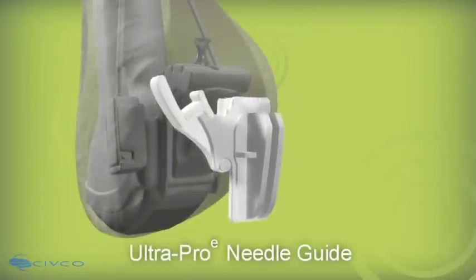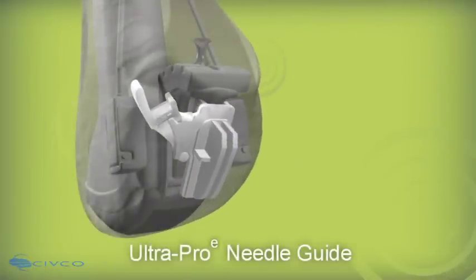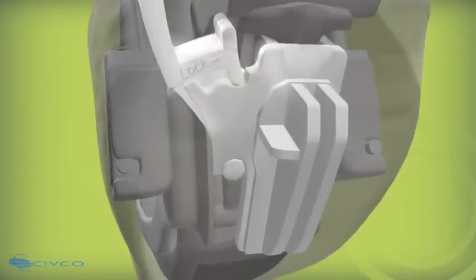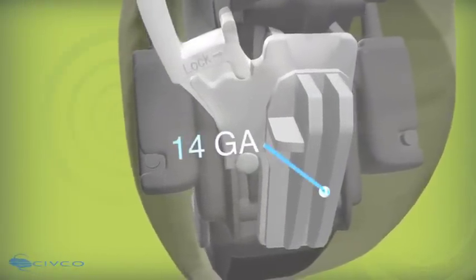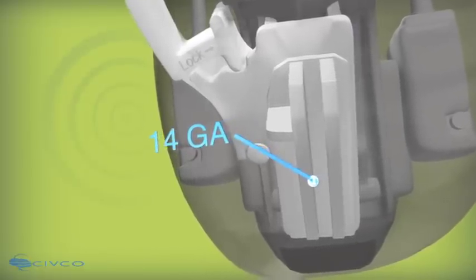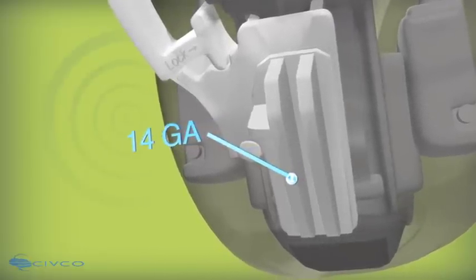Using proper sterile technique, attach the UltraPro E needle guide onto the bracket and lock in place with a single click. Through its open channel, the UltraPro E facilitates the initial orientation of the track needle. The guide attaches to the reusable tracking bracket and currently accepts 14 gauge and smaller instruments.